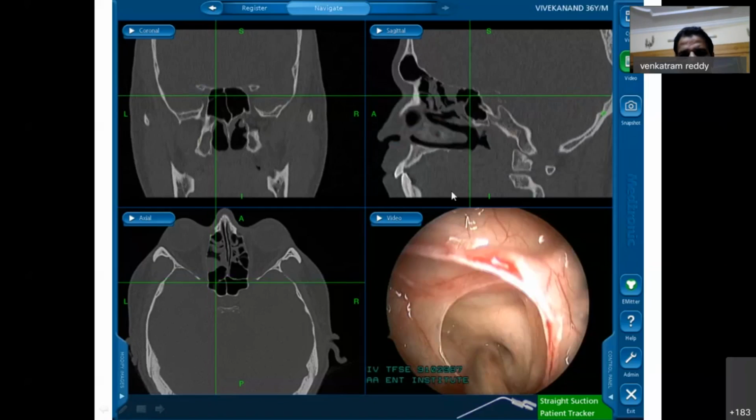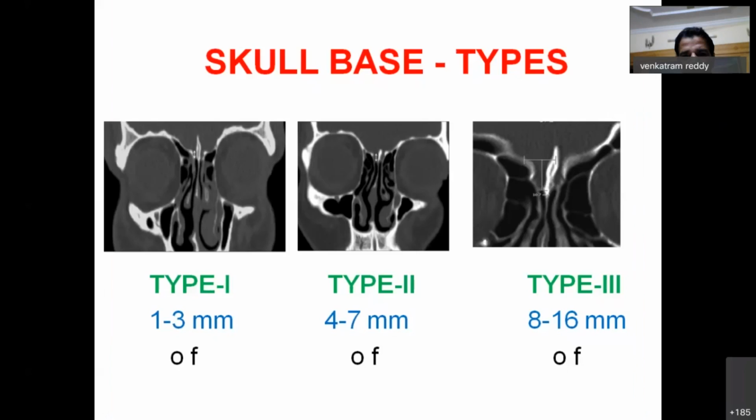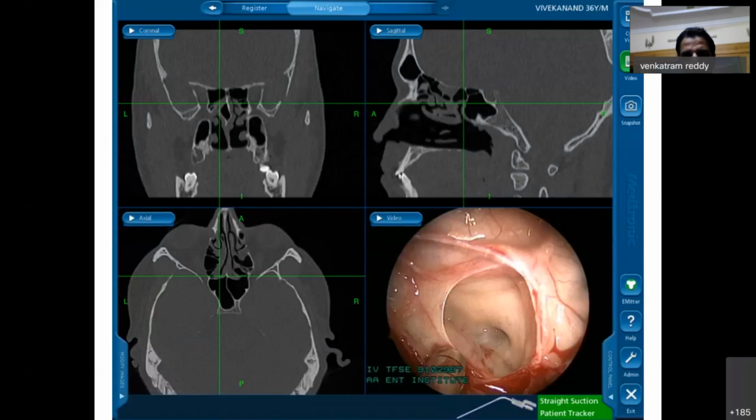And this is the area wherein you can see here, this is the curved optic groove, and you can correlate this with the 3D reconstruction films with the DICOM software. And again, you can see this probe is at the sphenoidal entry and in the posterior.